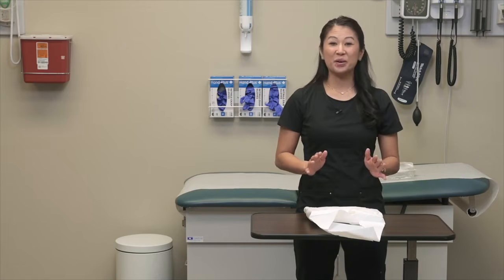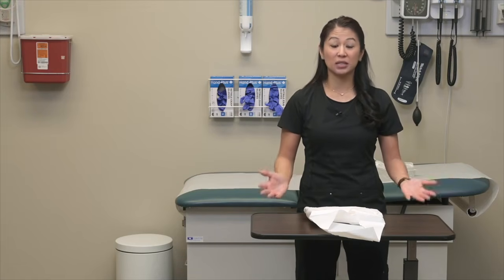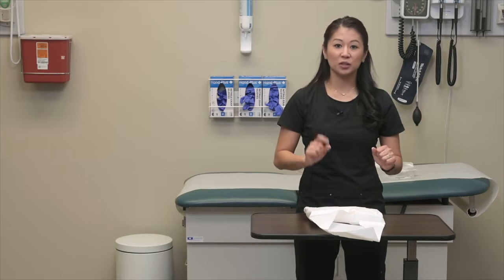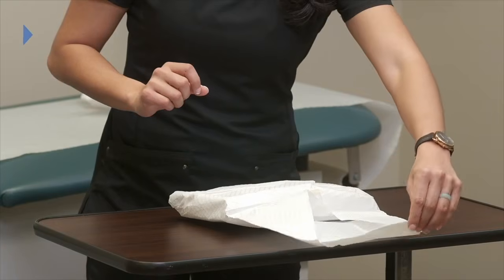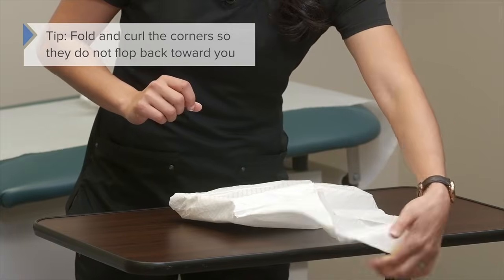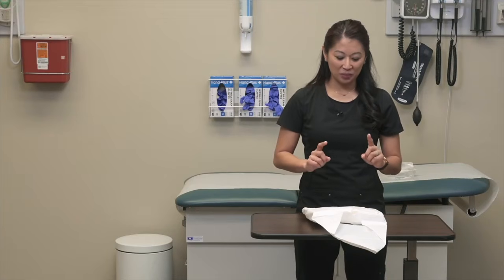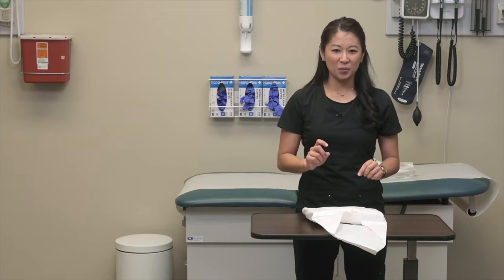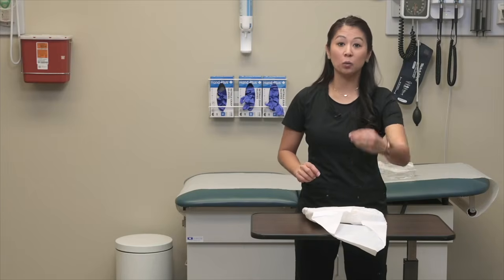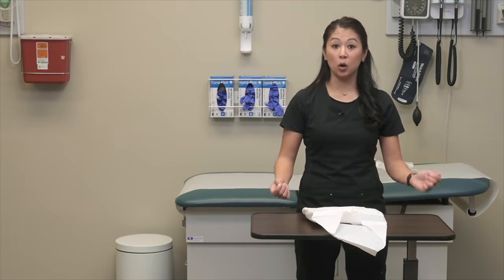So one thing to remember about sterile kits and these fields, it's really tricky because sometimes this will try to flap back open on your sterile field. So a little trick I like to do is take these corners and fold them on the outside and curl them so they don't flop back this way. The other thing you just saw me do is touch the outside. We'll talk about that in just a second. So once I've taken the top flap and opened it away from my body, there's two side flaps and I'm going to take each one and open those.